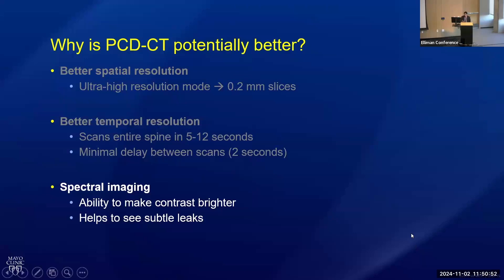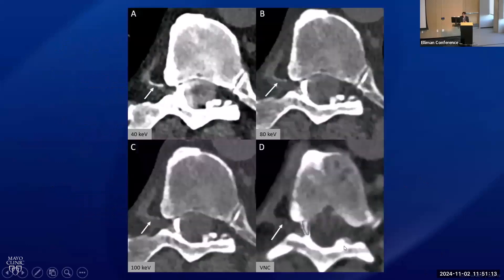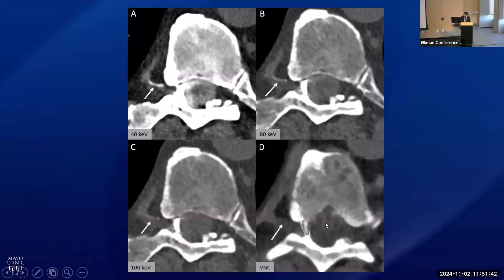The last main advantage is that photon counting CT confers spectral imaging — we can detect the energy levels of the photons hitting the detector. One thing you can do with spectral imaging is make contrast look even brighter than it actually is, which really helps when looking for subtle CSF leaks. Here are four images from the same patient at the same slice. The top left uses spectral imaging to make the contrast exceptionally bright, and you can see a little paraspinal vein filling up with contrast — a very clear CSF venous fistula. It's much harder to see when reconstructing at different energy levels without capitalizing on this benefit.